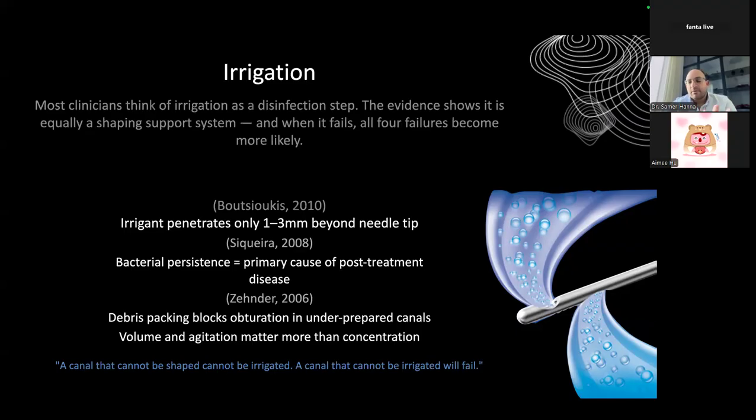So the fight was always between 1% sodium hypochlorite and 5% sodium hypochlorite, but again, the amount of irrigant introduced and the activation and the agitation is more important than the percentage of the sodium hypochlorite. A canal that cannot be shaped cannot be irrigated. A canal that cannot be irrigated will definitely fail. Always remember this. Always put it inside your treatment room. Just remember this extremely.